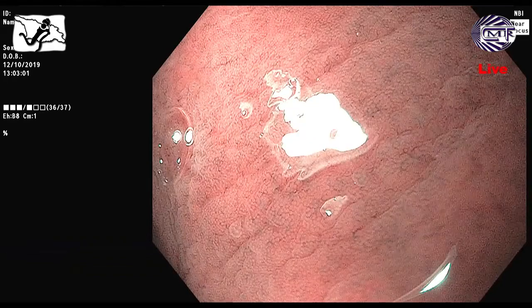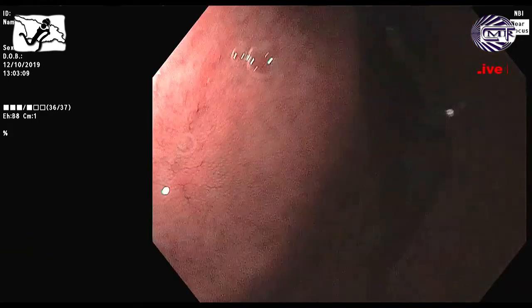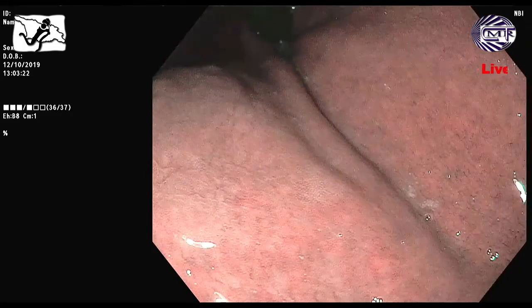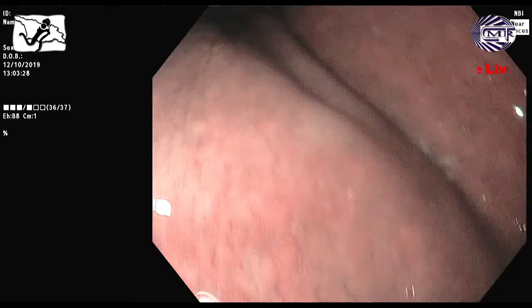How about it? A little bit swollen, honeycomb shape, right? Don't forget to remember, this polyp is not like malignancy, right? Today I showed a lot of pictures of how to check the malignant lesion here, but this is relatively regular and usual, the honeycomb shape like here.